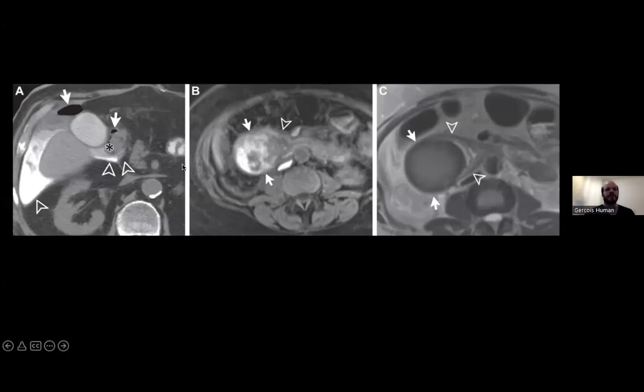So these are just some images showing trauma: patient A, and then the same patient, B and C. A is just showing a non-contrasted CT image in a patient who had oral contrast to drink, and then showing massive amounts of contrast in the peritoneum. And it appears to be originating here from the pancreatic duodenal groove, so indicating disruption of the lumen.